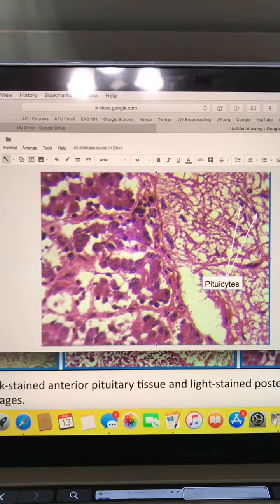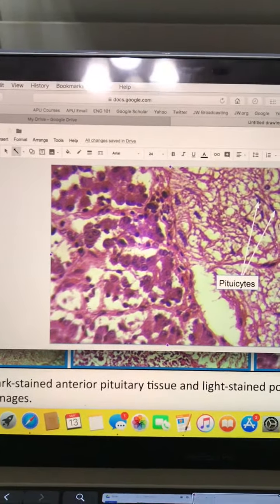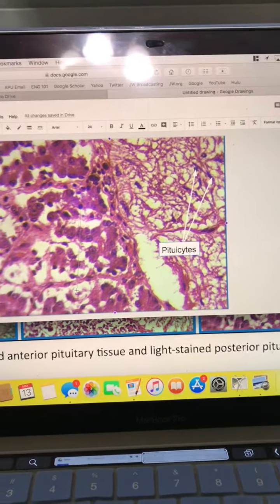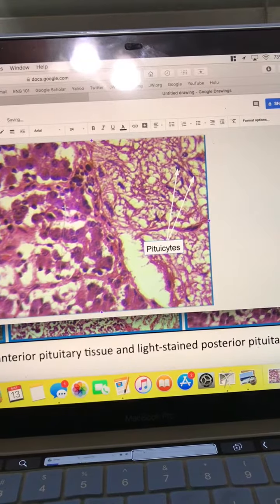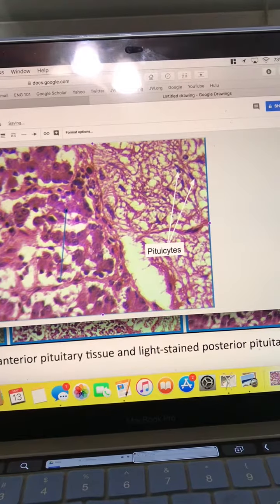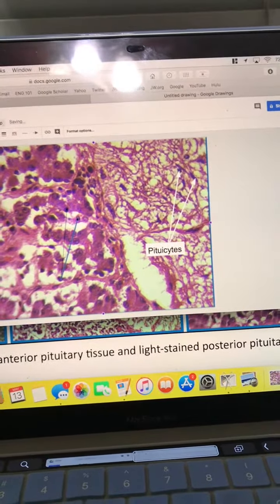Next I'm going to digitally label the acidophils and the basophils. So the basophils stain blue and the acidophils stain red. So these are all the basophils. Oh, wrong direction. And I'm going to point to multiple ones, so I'll just pick one. And I'll change their line weights again to 4.